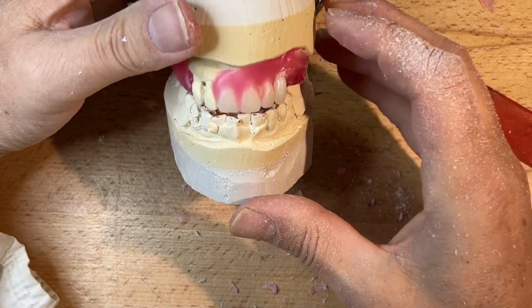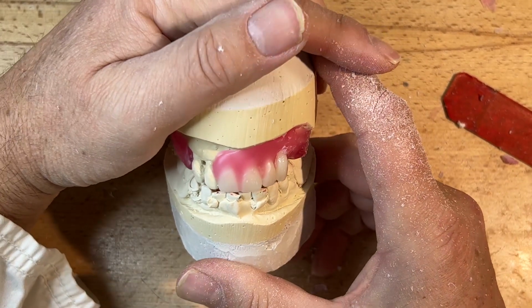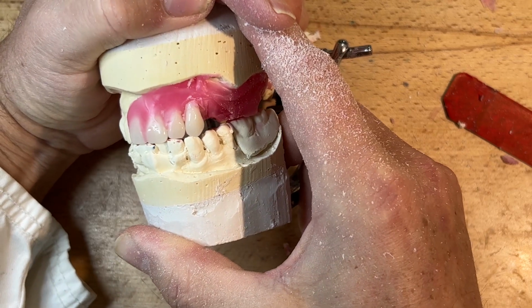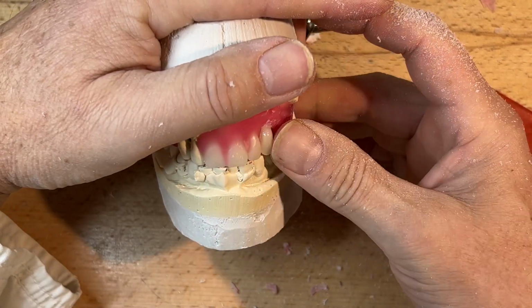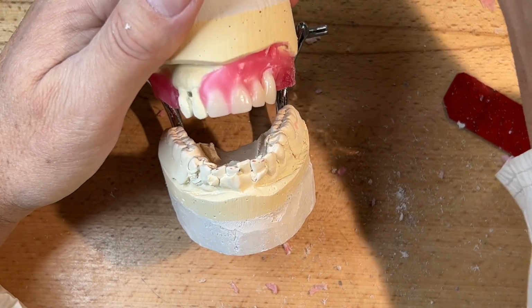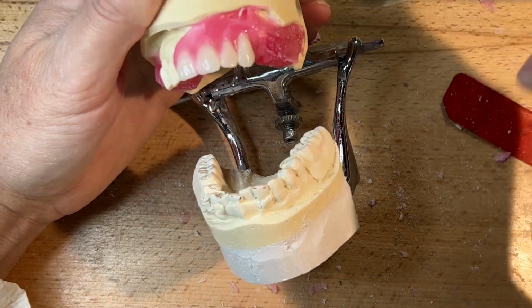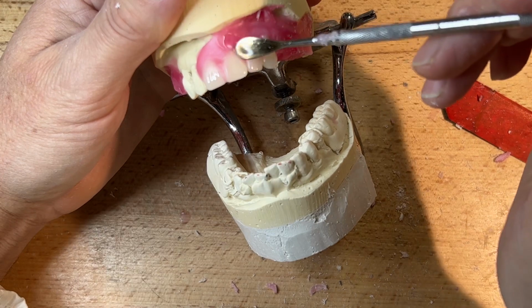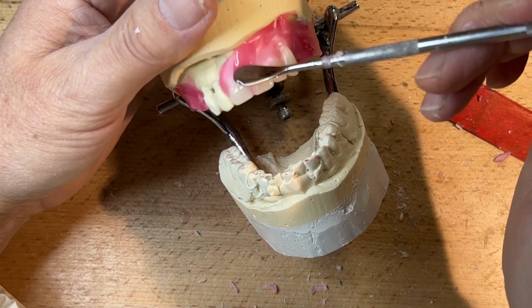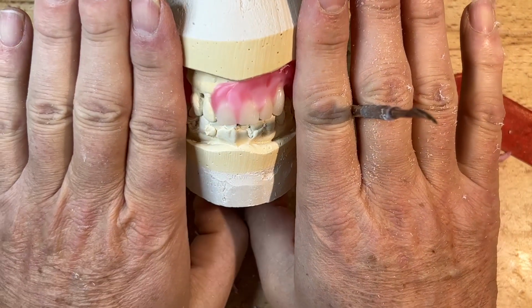The canine, the corner tooth, is really the most important tooth in any kind of smile, dentition. This is the segue between anterior and posterior. You can see the contact I've made on this side. This is the transition now between anterior and posterior, where the posterior has more growth lobes, talking histologically speaking, and the evolution from the anterior to the posterior of the human dentition. This corner tooth seems to be the most important. Framing of the smile.